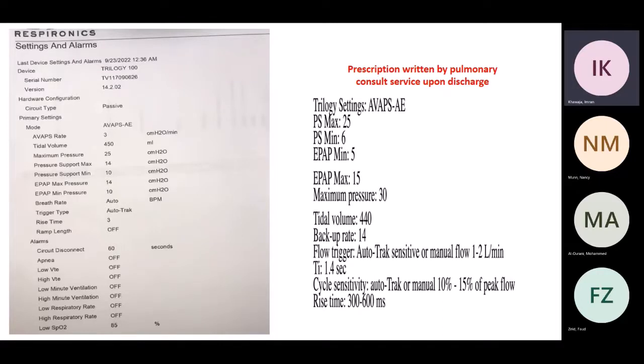So this is what you get in your compliance data. The first thing I looked at is the settings that her machine is programmed at. This is what I asked Rami to do, and I think he clearly gave them the recommendation, but it's not being applied to the patient. Most of the things that we requested, they did not do. I don't know, maybe they didn't look at this and they just used generic settings.